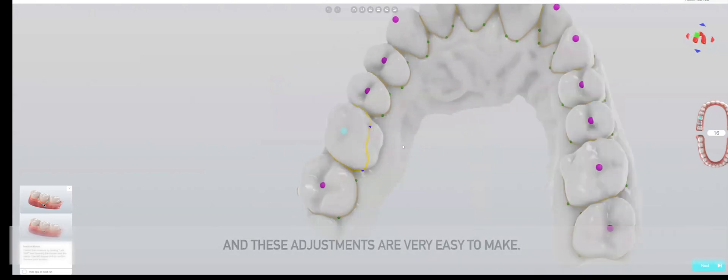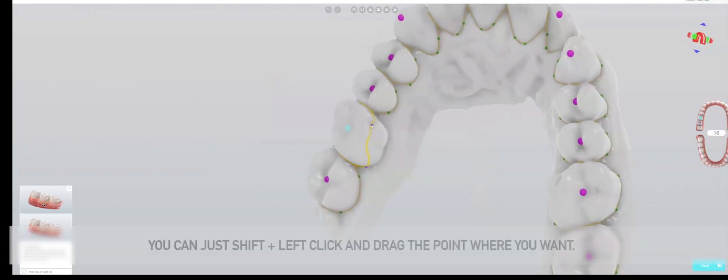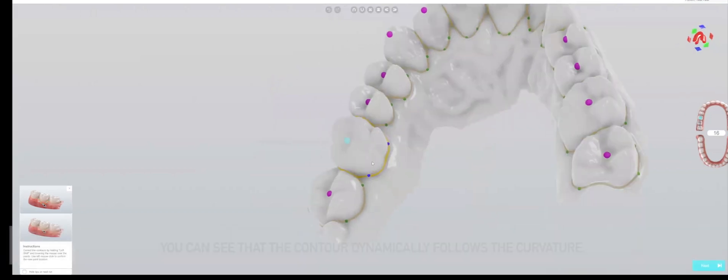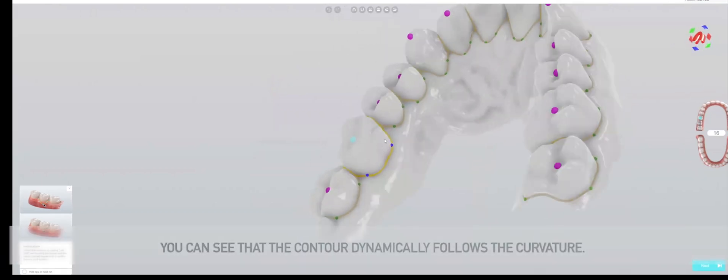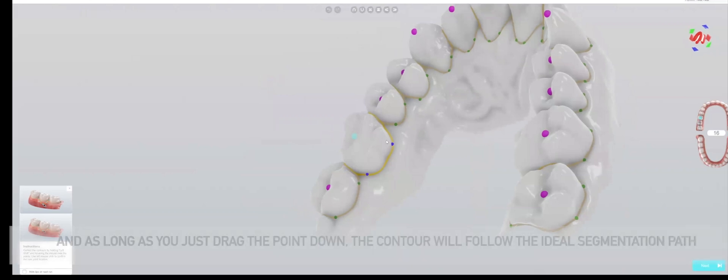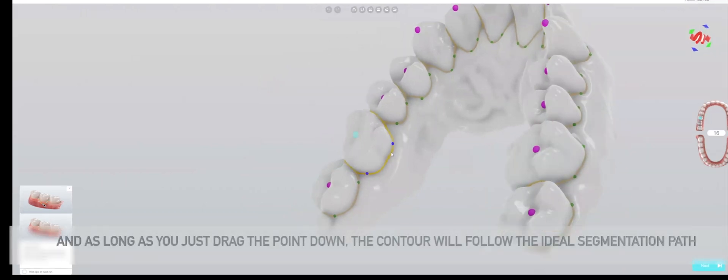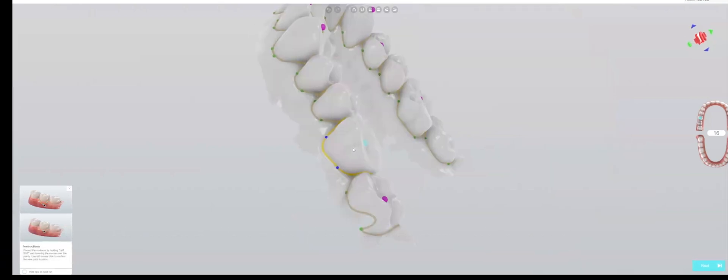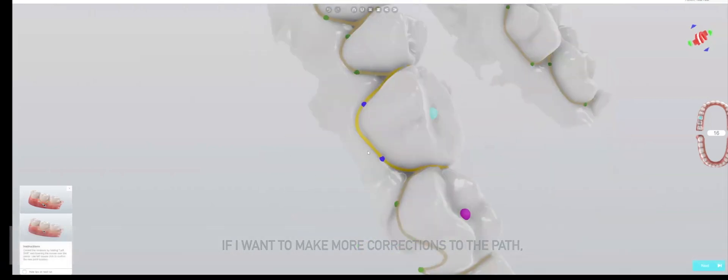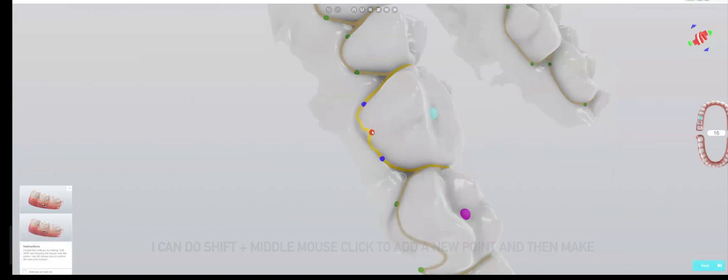There are occasional adjustments that you need to make, and these adjustments are very easy. You can just shift left click and drag the point where you want. You can see that the contour dynamically follows the curvature. If I want to make more corrections, I can do a shift middle mouse click to add a new point and add more flexibility to the curve.